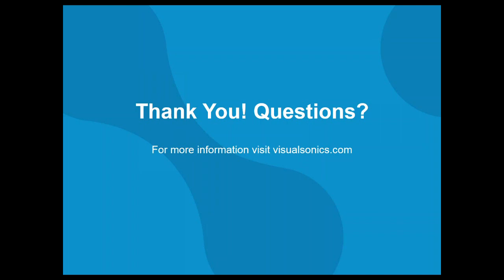So we've had a few questions come in along the way. I sent a couple of them over to you, but I don't know if you had noticed during the presentation, so I'll read them off. No, I haven't. Sure. So one of the first questions that came in was, can we image the brain through the mouse skull? So if you want to take that one.